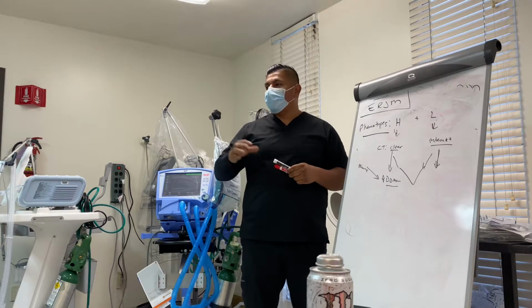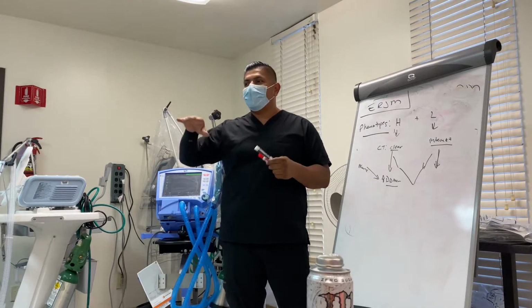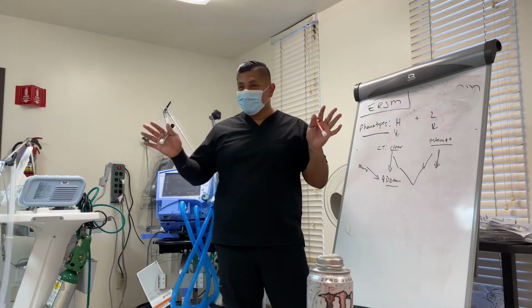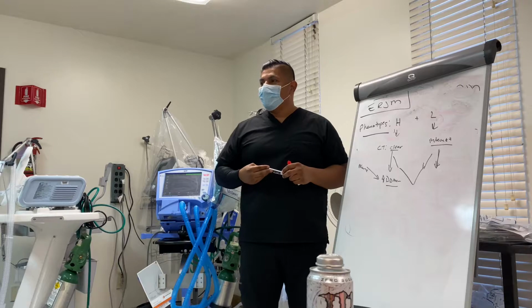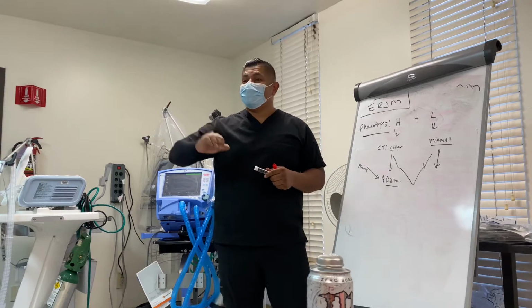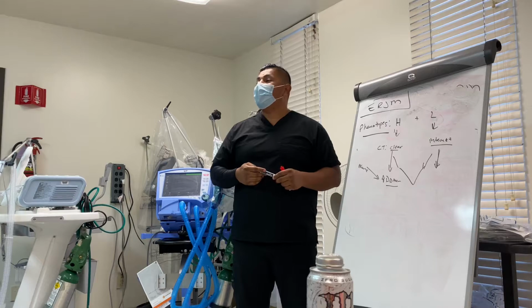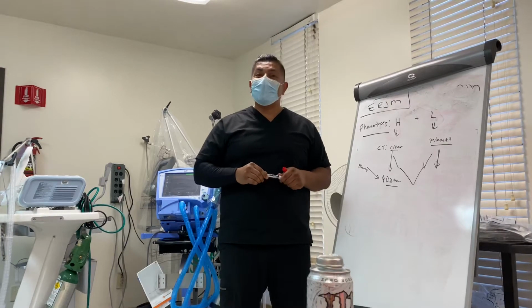Okay? Now, unfortunately, if in the end our patients have gotten so bad, they have actually needed something called extracorporeal, ECMO. Yeah, ECMO. So it's basically a bypass for the lung, right? Unfortunately, and this is the reality of it, I'm trying not to get political, but not everybody qualifies for that. I'm just curious, because ECMO is very expensive. Does anybody know how much it costs? Well, it lasts 14 days. One round is 14 days, and you better have insurance because it is 1.5 million per round. And not every hospital has it, assuming there's a technician on board.